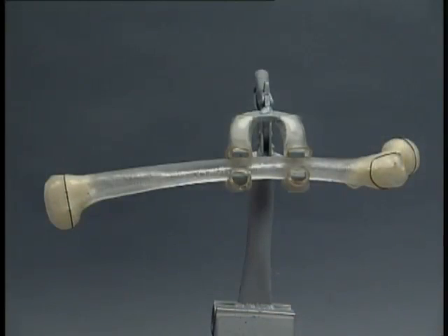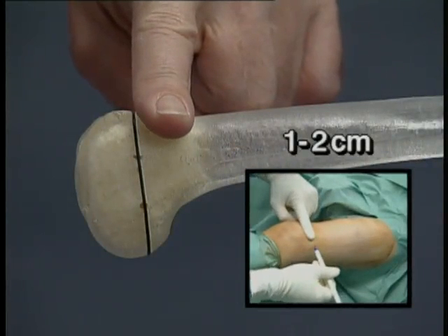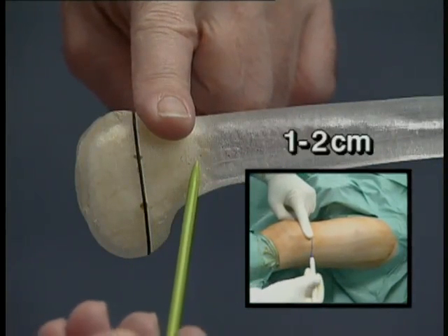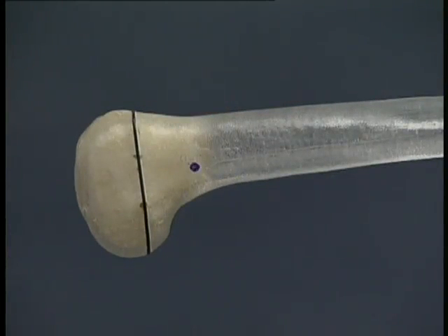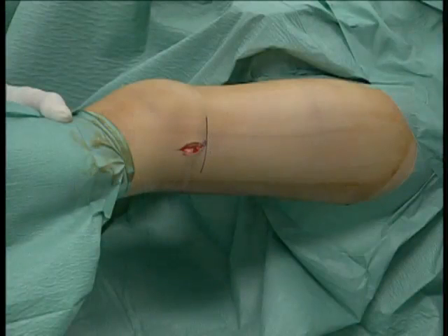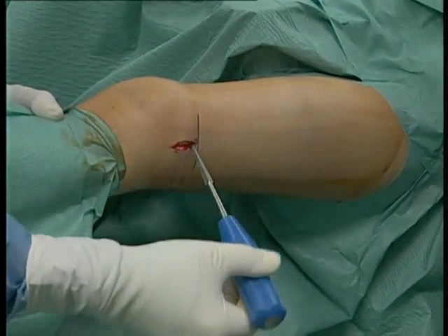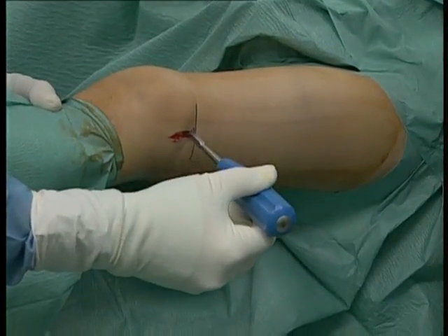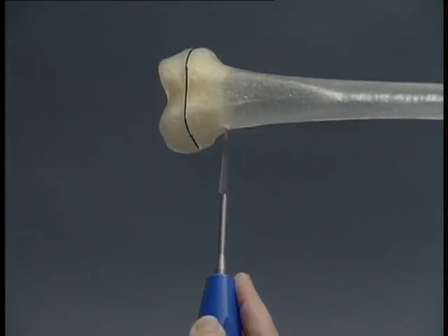For the ascending technique on the femur, the insertion points are one to two centimeters proximal to the distal epiphyseal plate — in children, about the width of one finger proximal to the upper pole of the patella. The intended insertion points should be checked under the image intensifier. Skin incisions are made at the planned insertion points, running distally for three to four centimeters depending on the size of the child. At the proximal end of the incision, the awl is inserted vertically down to the bone in the midline of the femoral axis, and with rotating movements a center mark is made.